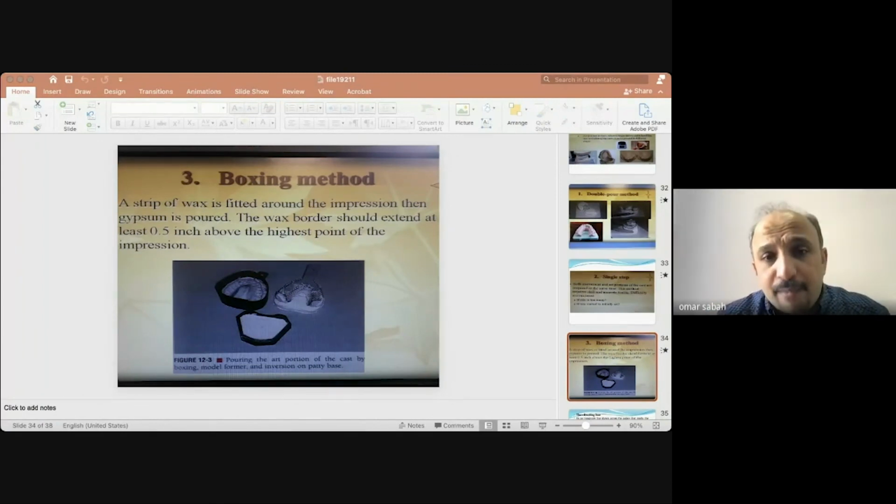هاي البيس اوكي، هاي البيس لازم اعملها اما انا بنفس الماتيريال مالتي، اما الستون، او اطيق اعملها بيش بالبلاستر. يعني دو ديفرنت ماتيريال. انا حصب بالقاعده مالتي ستون حتى تتحمل بريشر وهيت ان شاء الله بطريقه الكيورينج مال دنتشر بيس. وبعدها انا اطيق استخدم البيس بلاستر. البلاستر ما يهمني بعد، لانه هذا مجرد راح اقعده على ارتكليتر اوكي. فالتكنيك هذا يسمونه تو ستيبس.